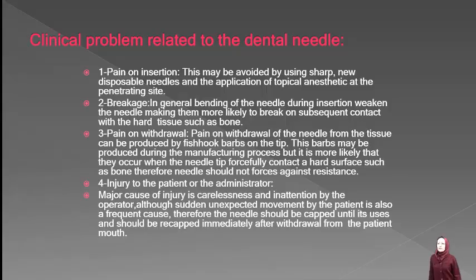Clinical problems related to the dental needle. Number 1. Pain on insertion. This may be avoided by using sharp new disposable needles and the application of topical anesthetic at the penetration site. 2. Breakage. In general, bending of the needle during insertion weakens the needle, making it more likely to break on subsequent contact with hard tissue such as bone.